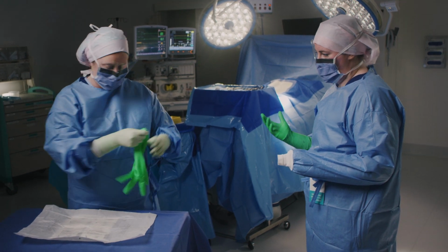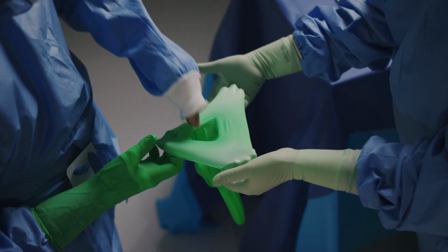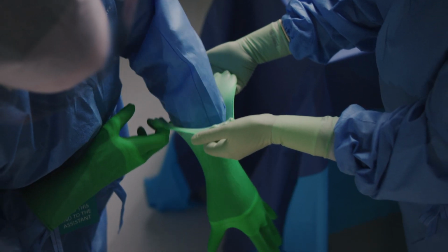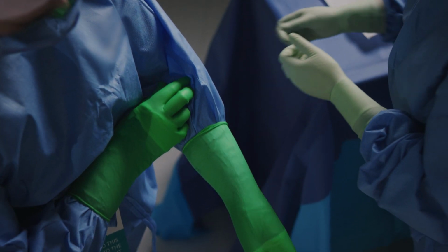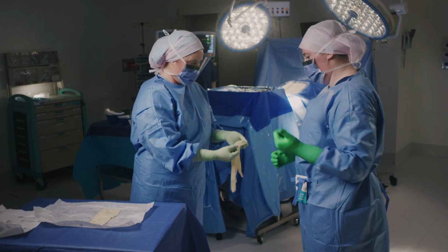The other hand will be repeated in the same manner as the first. With one hand already gloved, the team member can assist by pulling open the cuff while donning their ungloved hand. The assisted process is then repeated for the outer gloves.